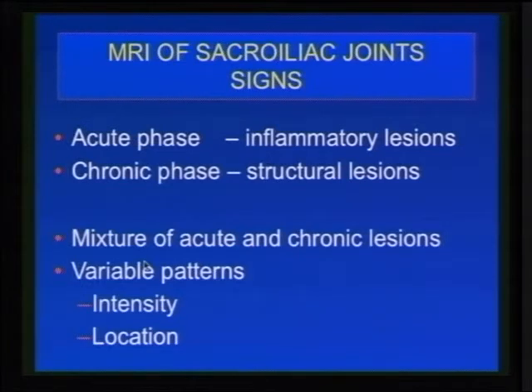So now, if we do MRI, Dr. Asif Saifuddin just now spoke about the inflammatory stage of the Modic classification, type 1, which is really important here. If you see edema, that means it's fluid. STIR is a fluid-sensitive sequence. It will be bright signal intensity. The fluid on T1 weighted will be low signal intensity. So if you see any changes which are high signal intensity on STIR and low signal intensity on T1, this is an acute inflammatory stage.